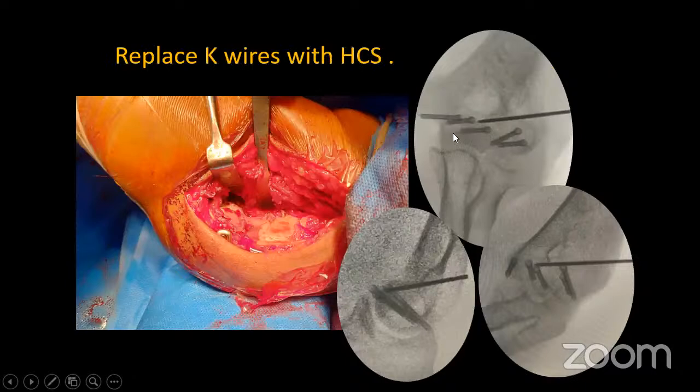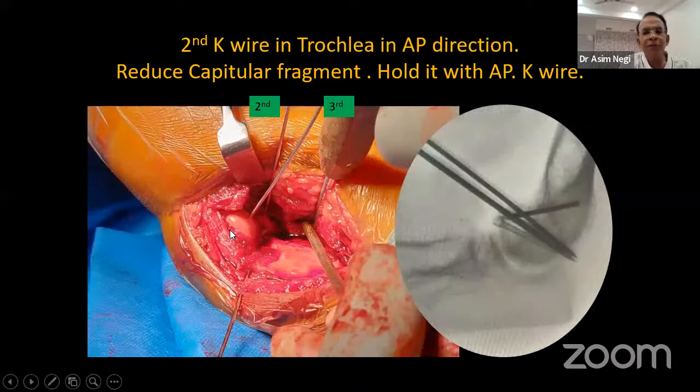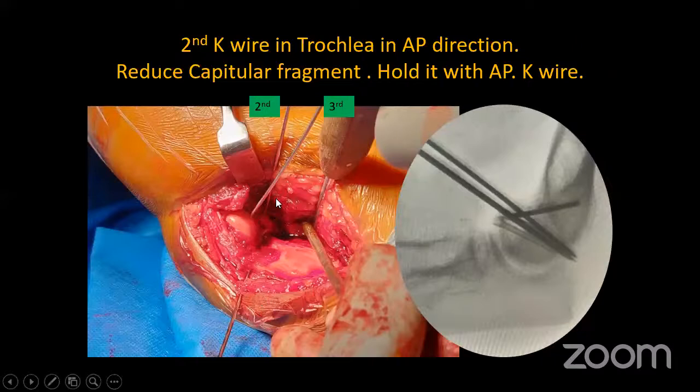Sir, where exactly is this Hohmann clamp? Pardon? How far medially is this clamp? This clamp is wherever you are passing the screw. You just bite it anteriorly and posteriorly, so that your fragment doesn't lose the reduction. It's only gentle. You don't crush that. The piece is very small. You don't crush. You just hold it like this.